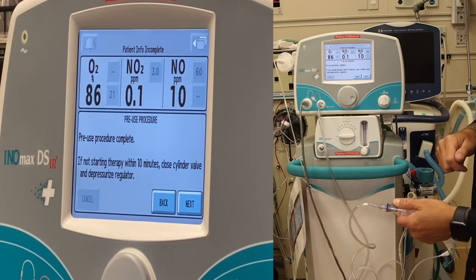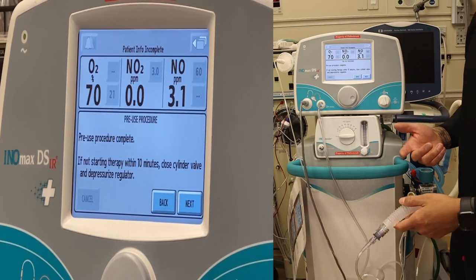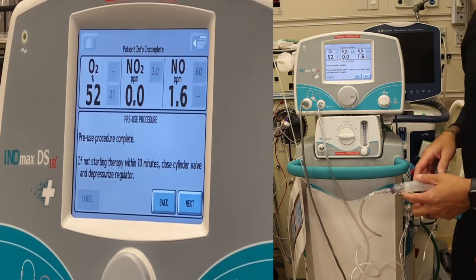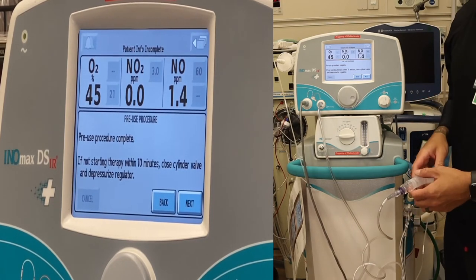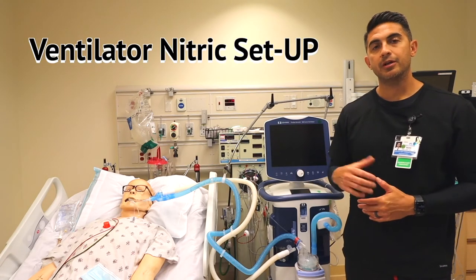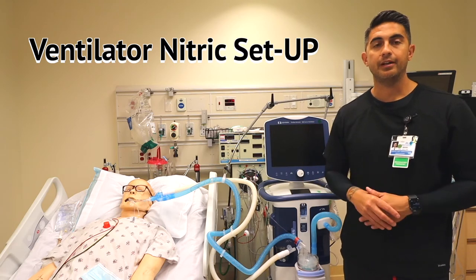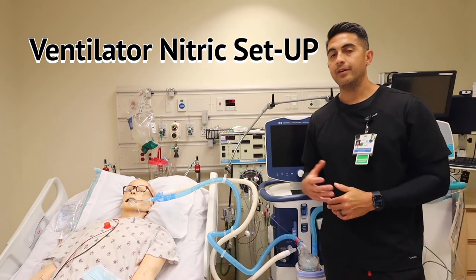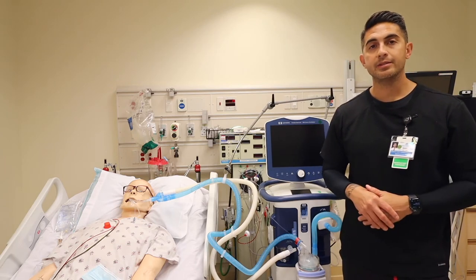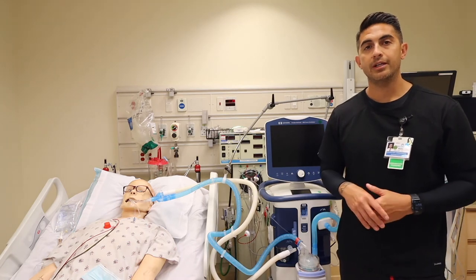Pre-use procedure is complete. If you're not starting therapy within 10 minutes, close the cylinder and depressurize the regulator. Now I'm going to show you how to place the injector module and sampling line in both an adult ventilator and a high frequency ventilator. First, verify with your INO that your pre-use checkout has been completed.